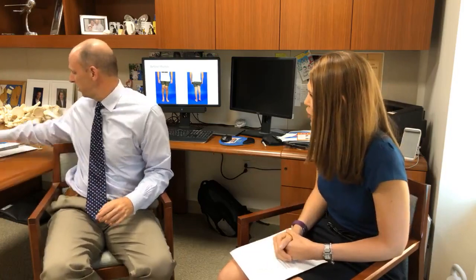It's still a risky technique. Anytime you're lengthening the bone, whether you use an external fixator or an intramedullary rod, it's still lengthening, and there are complications that can happen. But we've definitely demonstrated from a quality of life standpoint, it is a preferred technique. And I think you have a couple examples of the actual rods?